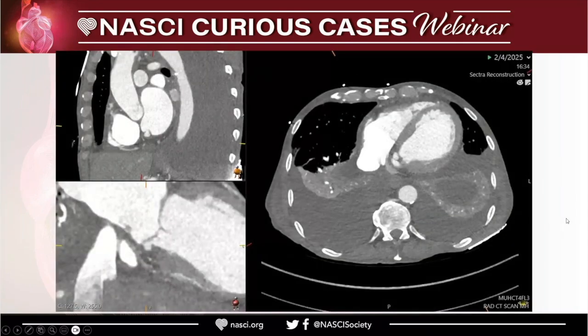Thank you. There's a question: how to differentiate from MAC? I guess we can use non-con to see if there's any calcification. Yes, yes. So we'll have to use non-con to differentiate caseous necrosis of mitral annular calcification. Yep. And in this case, there was no calcification.